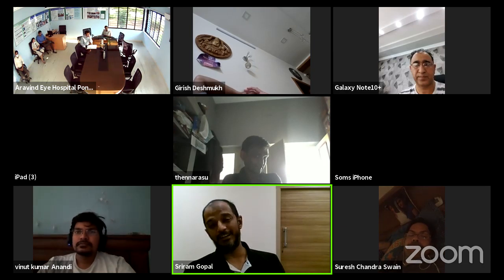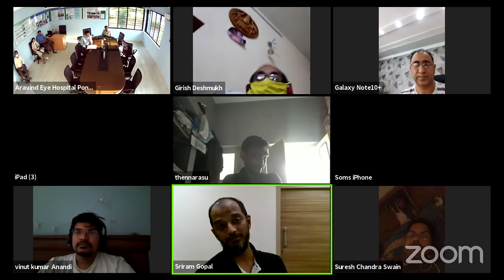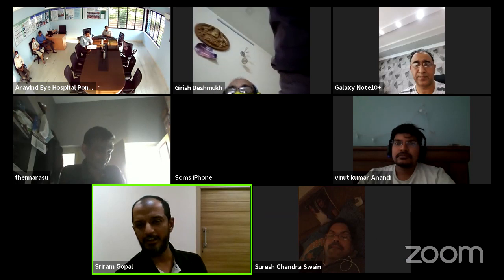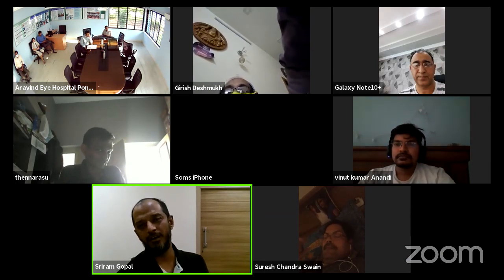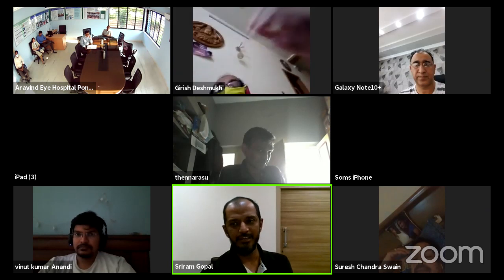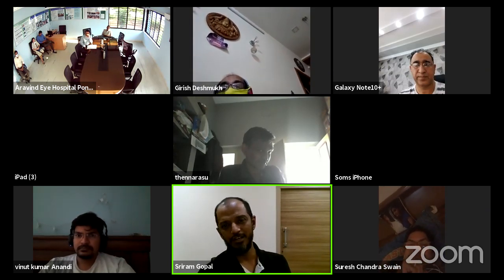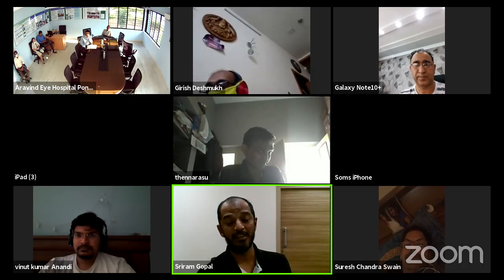I'll give you two very clear examples. You might find somebody with, like my last video I showed you, a lot of echoes in the vitreous on a B scan. You examine that patient and probably he won't even complain of floaters. It will be a very long-standing PVD, and all the ultrasound needs to have an echo is an interface which will reflect sound. The interface which reflects the sound need not really reflect light. That is a basic idea. If it reflects light, you will see it. The more it reflects light, the more you will see it. The more it reflects sound, ultrasound will pick it up.